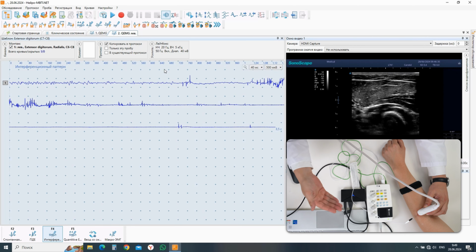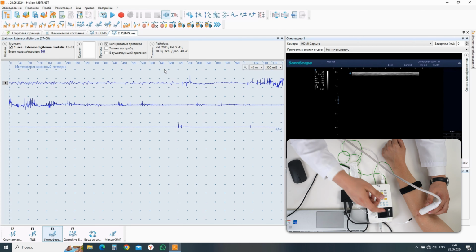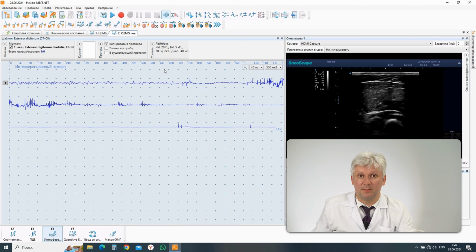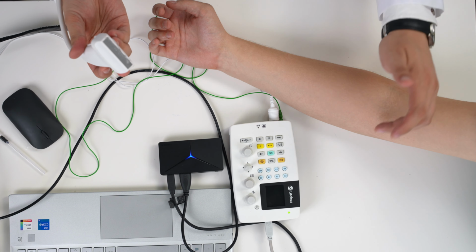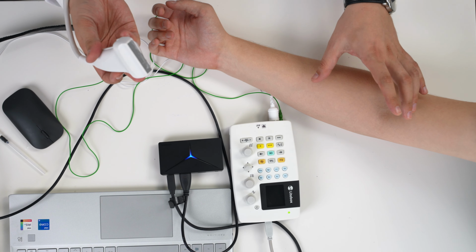So we've recorded interference patterns from multiple muscle segments, and we can analyze the potentials in these motor unit segments, and then collect already quantified potentials of motor units in different segments, and do statistical analysis. For imaging peripheral nerves, we will use standard ultrasonic access. For example, we now have the task of exploring the cubital channel area.